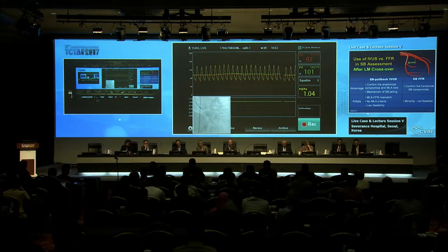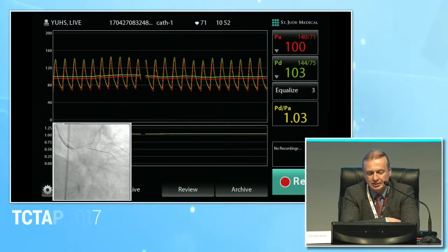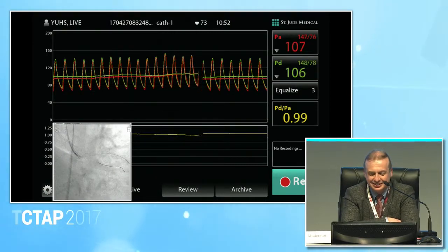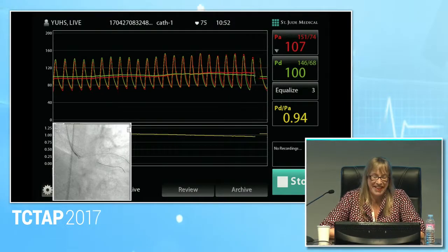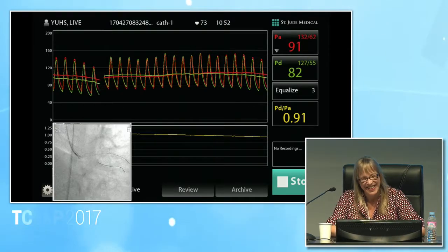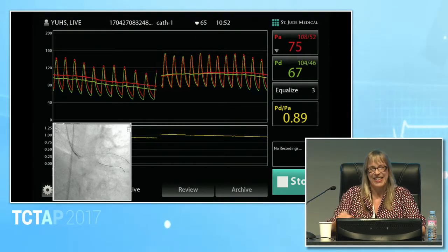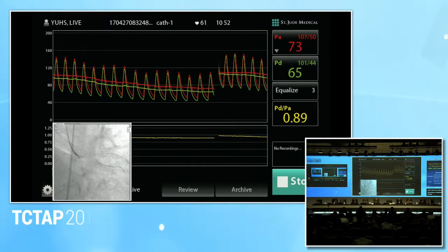Do you start it now with adenosine? Yes, okay, IV adenosine. It takes some time to dilate. We just check, did you administer some nitrates before? Yes. No. It's a bit of a conflicting answer. That's okay. Pressure down. It's real life. Okay, now we see that something happened. So not significant.